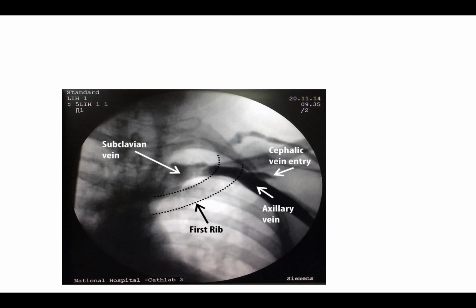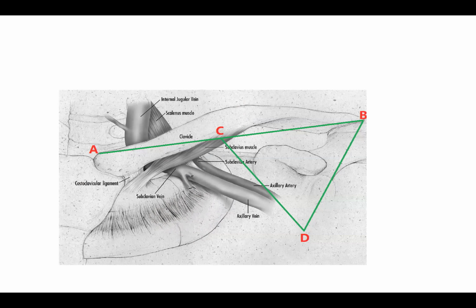That is all. Okay, so this also tells us the same direction that we have been describing, the subclavian vein, the subclavian artery. But I want to say here that if by mistake, as you are advancing, you mistakenly puncture the subclavian artery, there are key things to know it. One, the brightness of the blood.